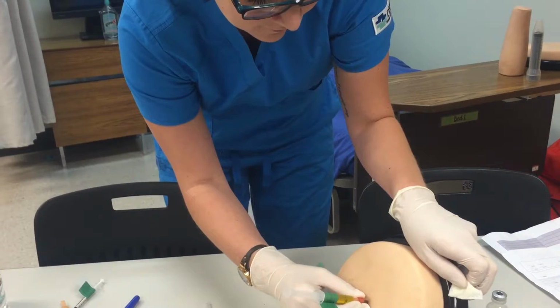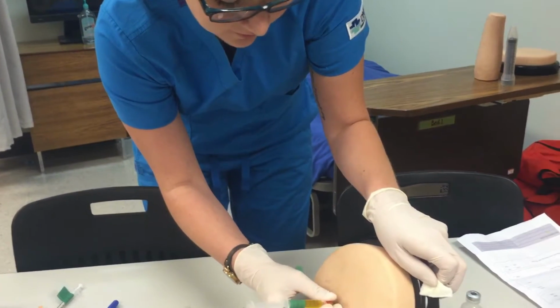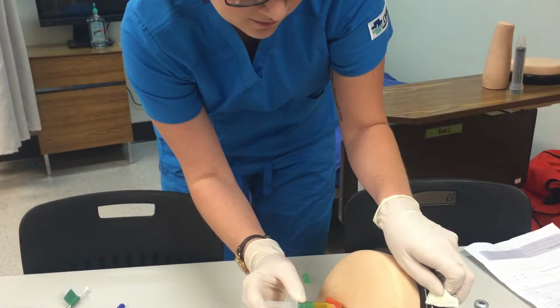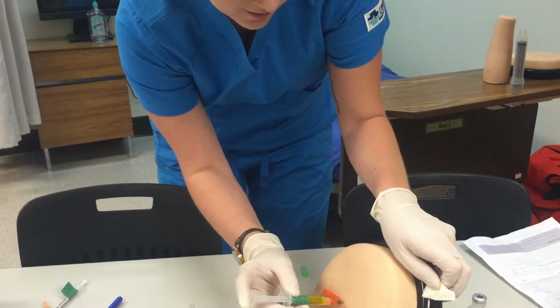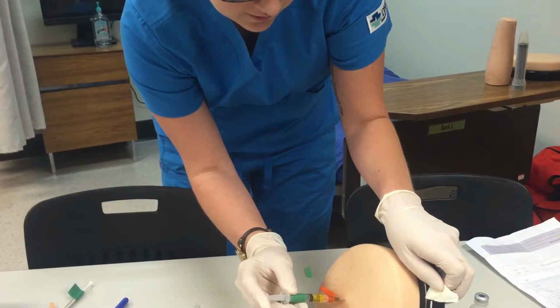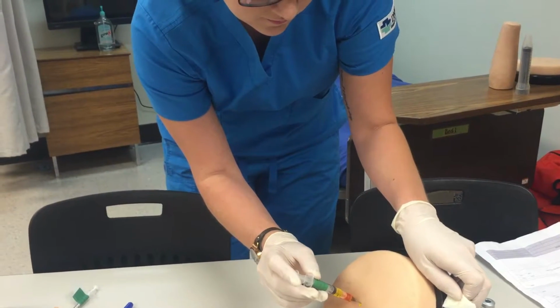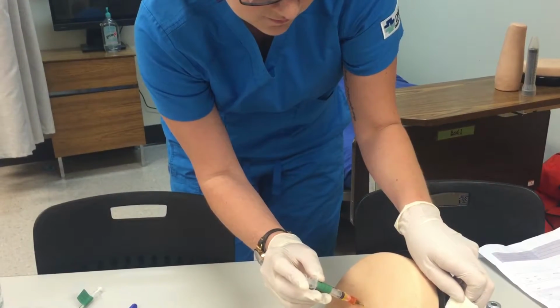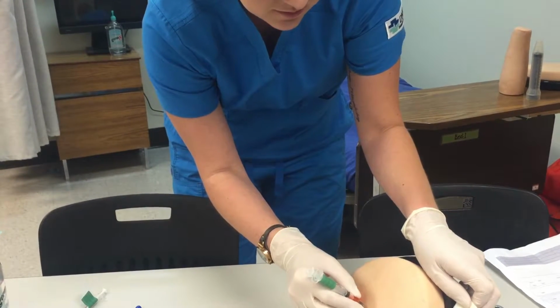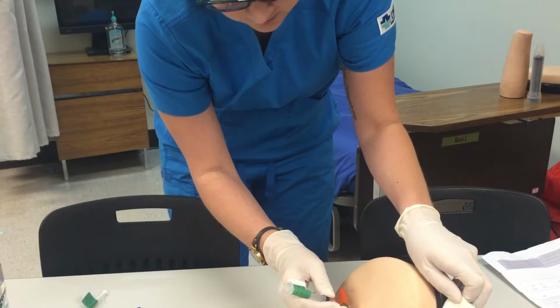If this happened in real life, that's what I would do in real life. That's how I'd fix it. I'd aspirate, and then I would inject. Very slowly. I'd hold it for a few seconds to make sure the medication was actually entered into the patient.